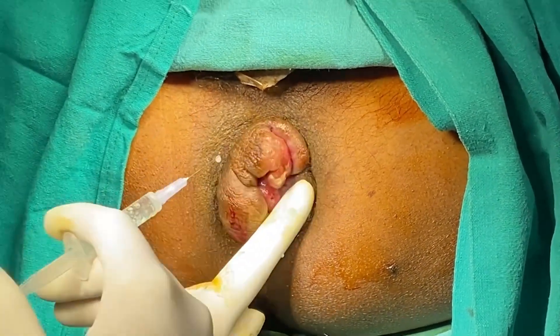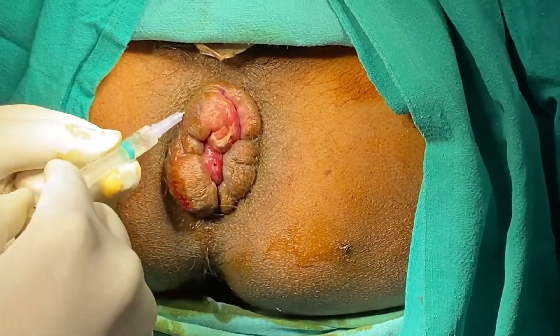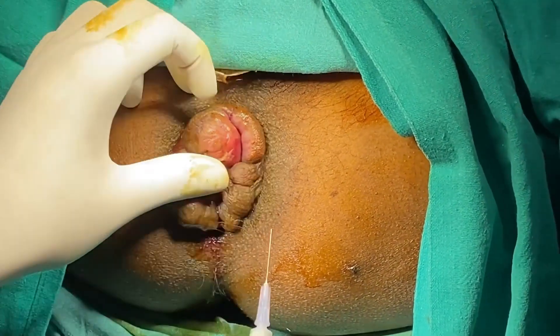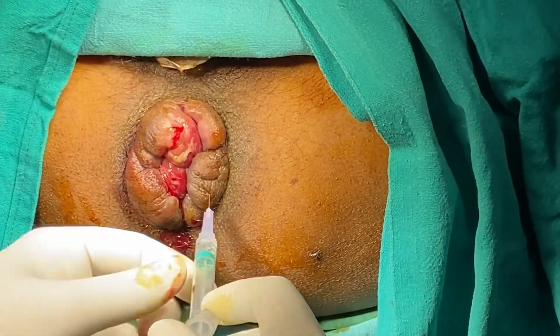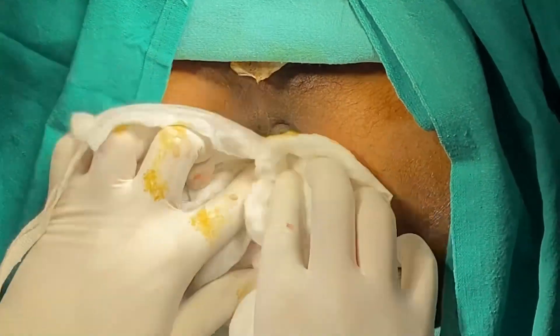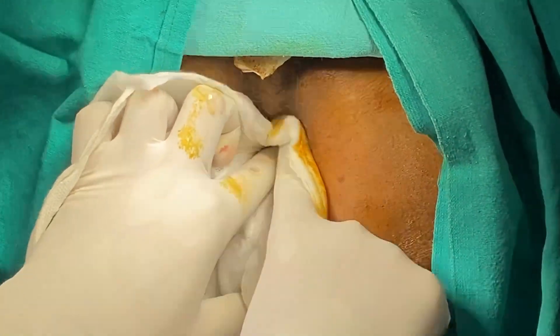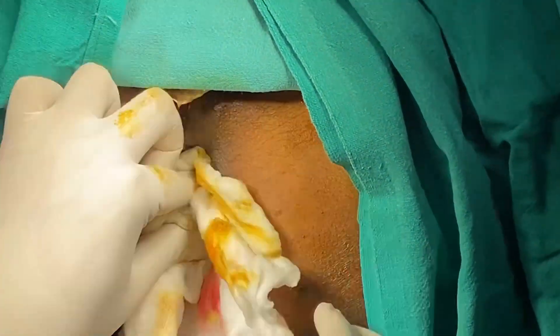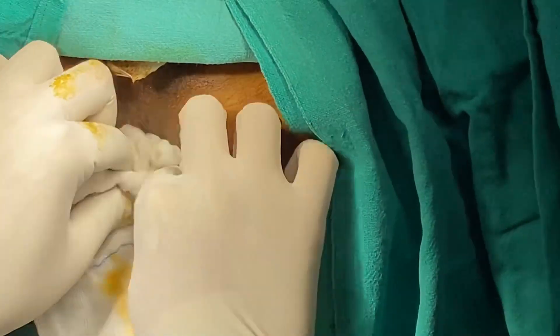First we will be cutting. I am going to cut now. I will make just a cut. The procedure is underway and I will be making the next step.